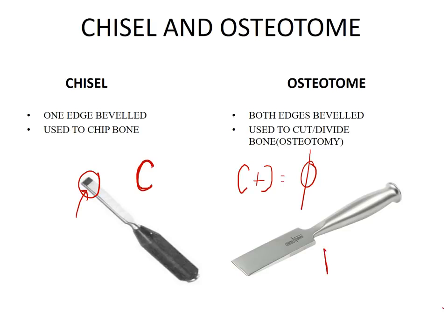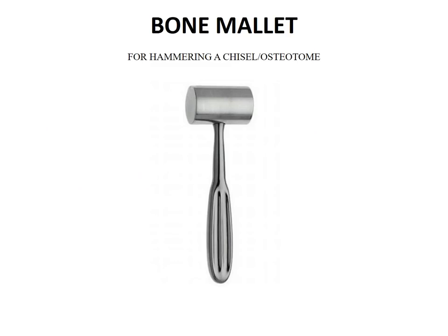It is high likelihood you will get osteotome. Chisel is a rare question to be asked. Then we have a bone mallet or a bone hammer, which is used along with the chisel and osteotomes in orthopedic surgeries. Bone mallet or a hammer.